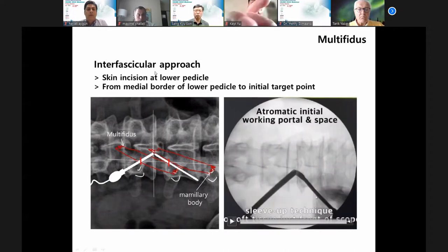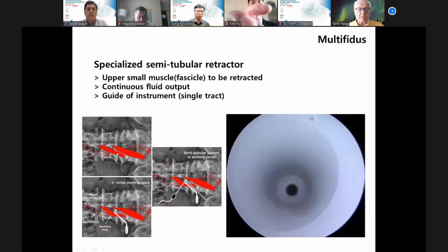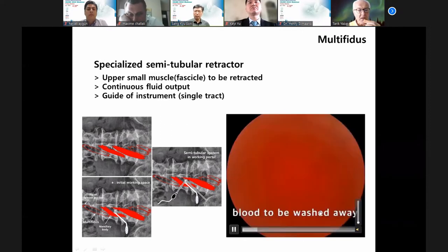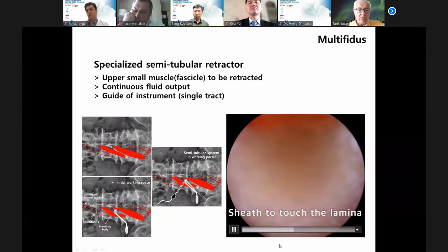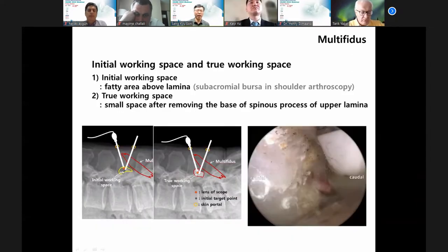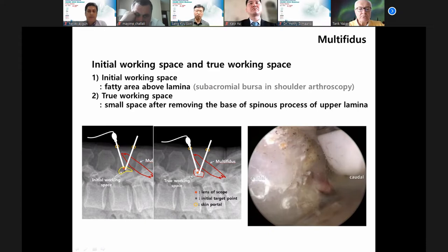Second: specialized semi-tubular retractor. This small muscle is the multifidus. This retractor retracts the upper small muscles. The initial working space and true working space are different. The initial working space is the fatty area above the lamina — similar to the subacromial bursa in shoulder arthroscopy. After removing the small bone, you can make a true working space.